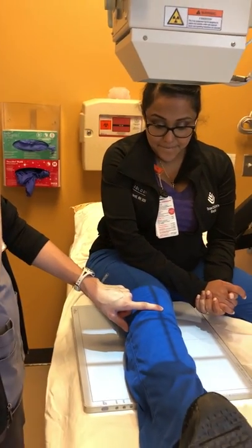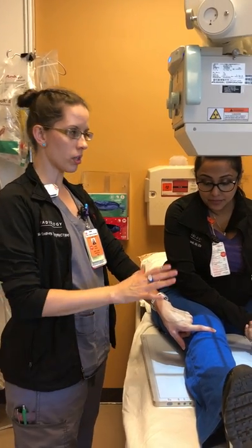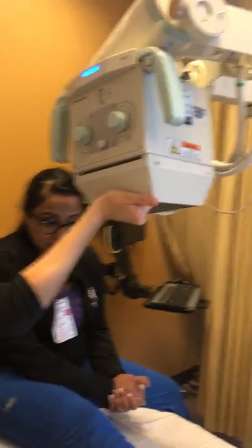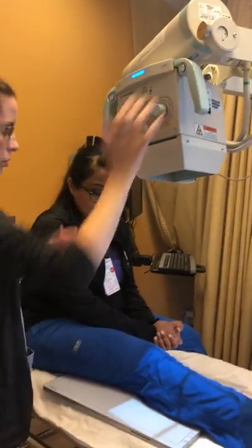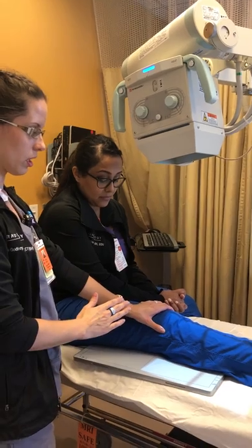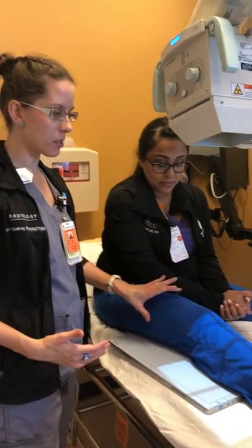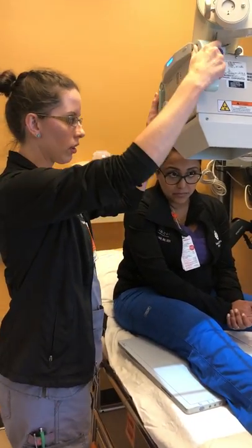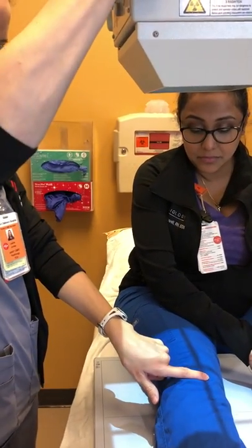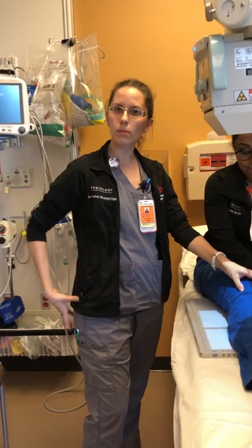For positioning, if the patient has very slim thighs and legs, you will apply a five-degree caudal angle — angled down toward the toes — to account for the angle of the condyles and tibial plateau and to get a nice open joint space. If the patient has average-sized hips, legs, and thighs, no angle is needed and you come in at a straight perpendicular angle, again at one-half inch below the apex of the patella.